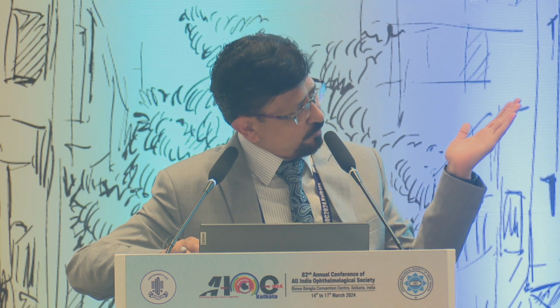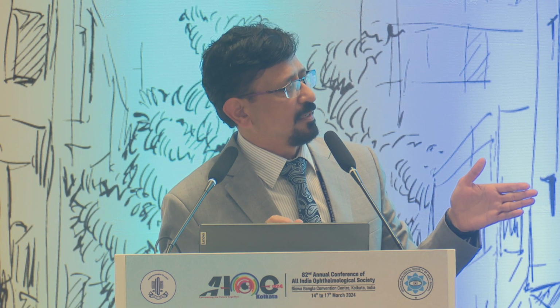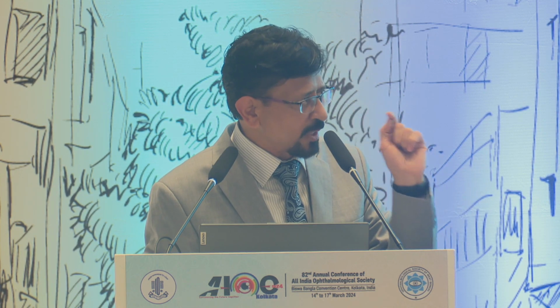So if you amputate the flap, it doesn't cause, actually it has been seen in studies also, and we have also noted that it is not the mathematical calculation that if you remove 100 microns, it will be about 100 divided by 15, and that much of a refractive error will be there. Most of the studies have shown that it is plus minus 1 diopters, 1.5 diopters, not more than that. Just one point has been noted, that there is some degree of astigmatism, particularly in microkeratome LASIK.